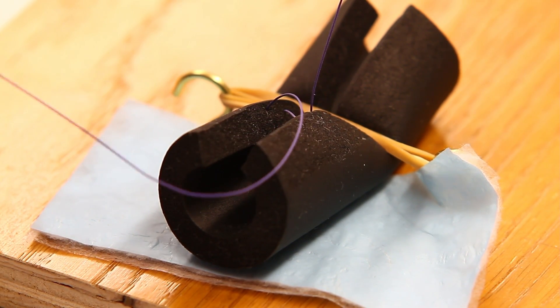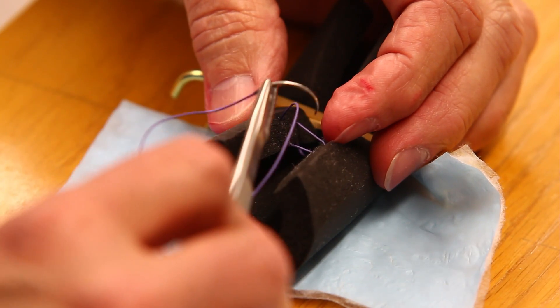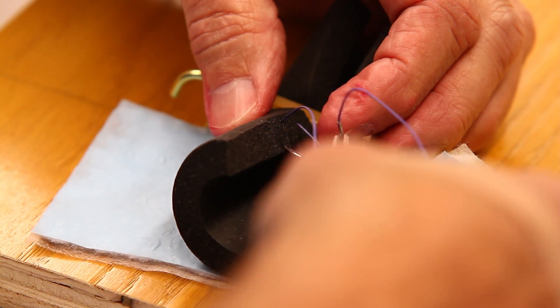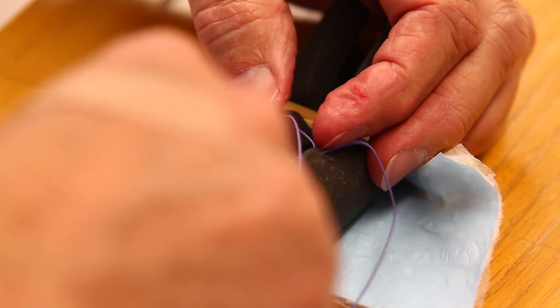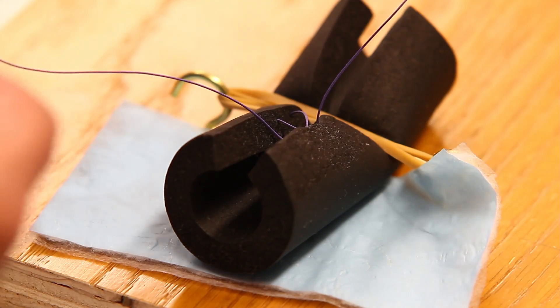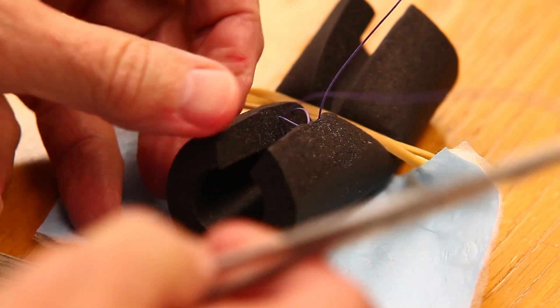This is slow, tedious work. It requires a soft hand, good light, and lots of patience. A careful approximation of this layer of rectal wall is the key to preventing rectal vaginal fistulas. So extra time and patience spent here pays off.